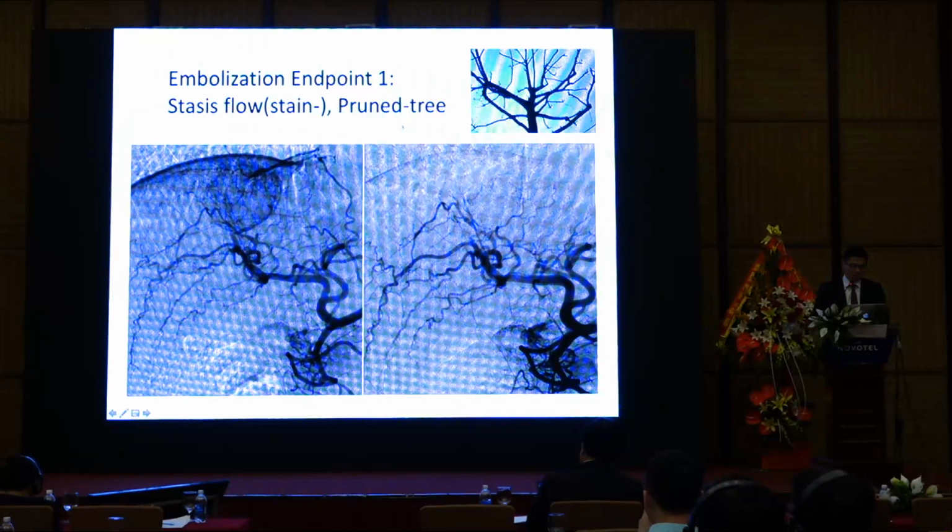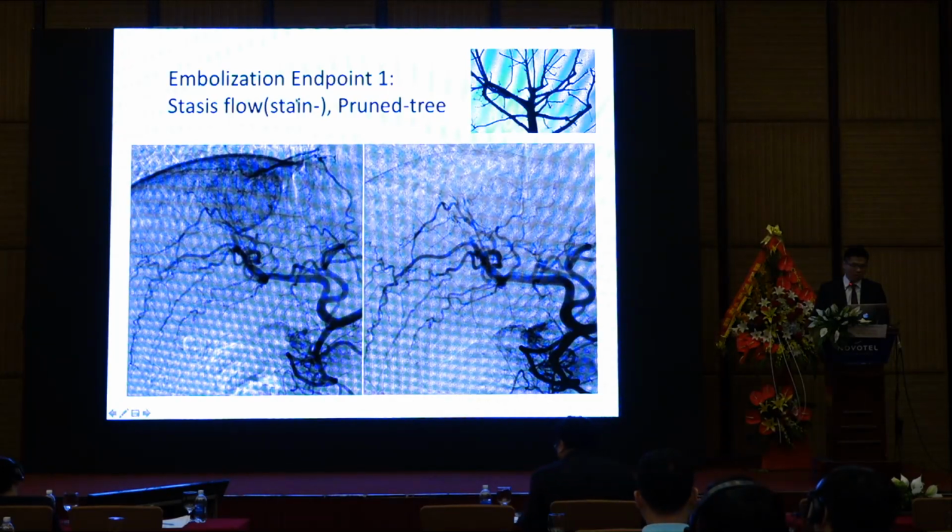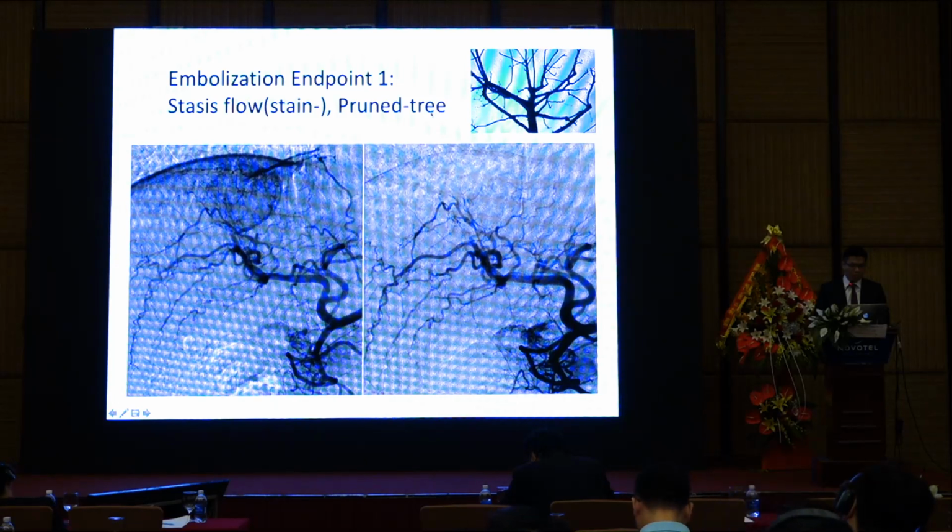So, which is the vanishing of the tumor stain. As you can see, there's a tumor here, but after embolization, it looks like a pruned tree without any tumor stain. But the feeding artery is still patent. I think this is a good endpoint.